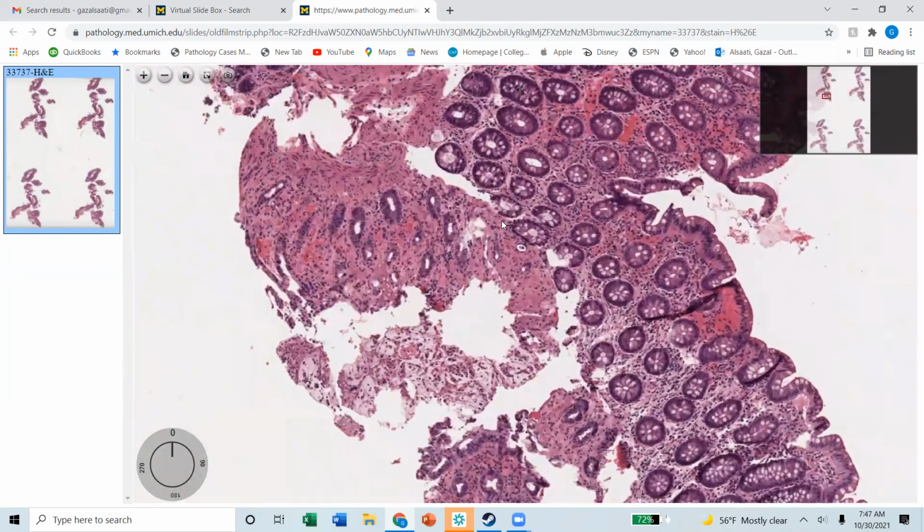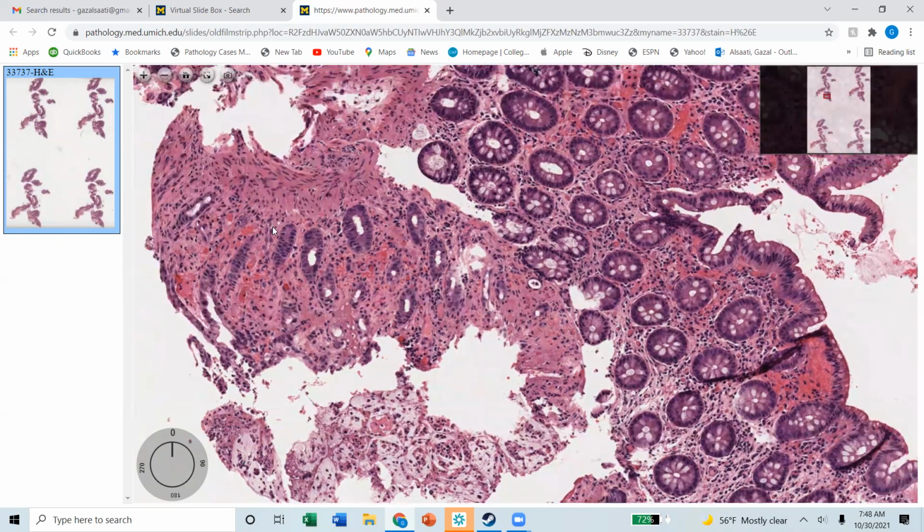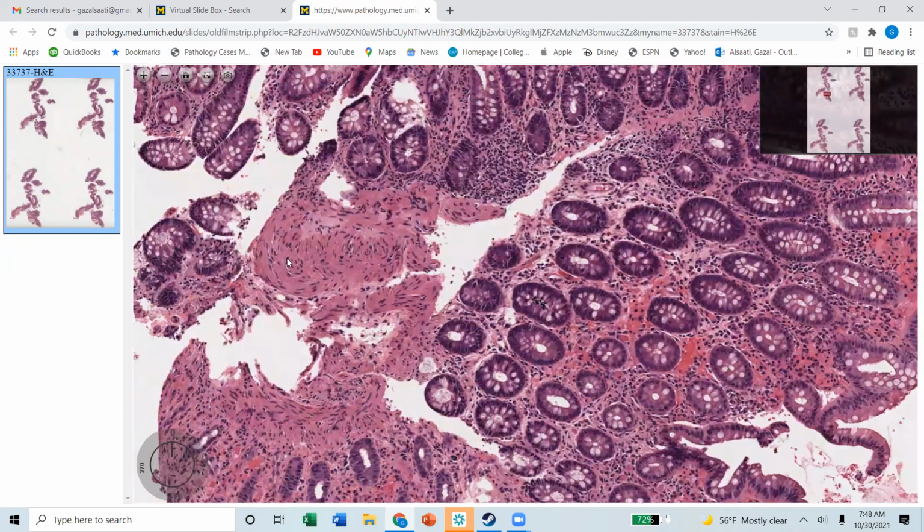This is a nice ischemic pattern injury, and you will say that this can be seen in ischemic colitis and infection. Bugs such as parasites can also cause that, because they can go into the vessels and occlude them.